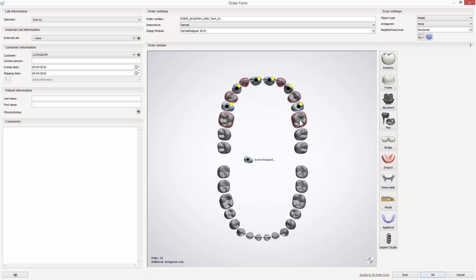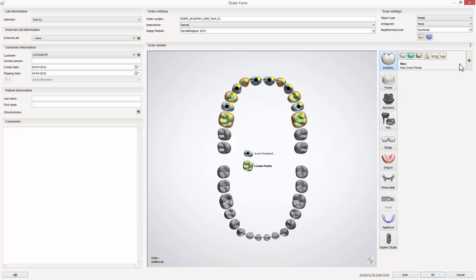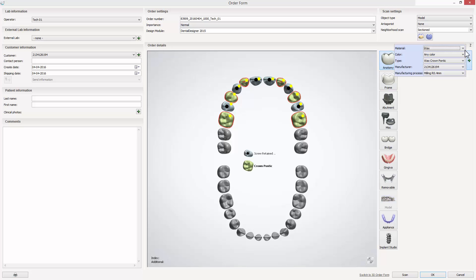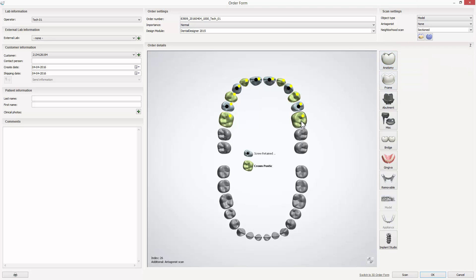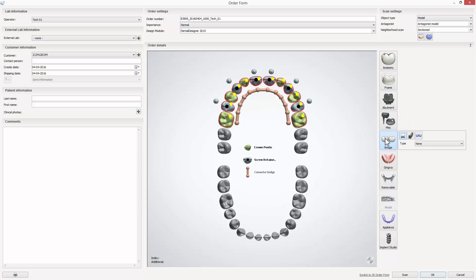Then choose the teeth for pontics and choose anatomy pontic from the indications list. Also remember to select zirconia as material. Now mark all teeth and select bridge. Choose none as the connector type.